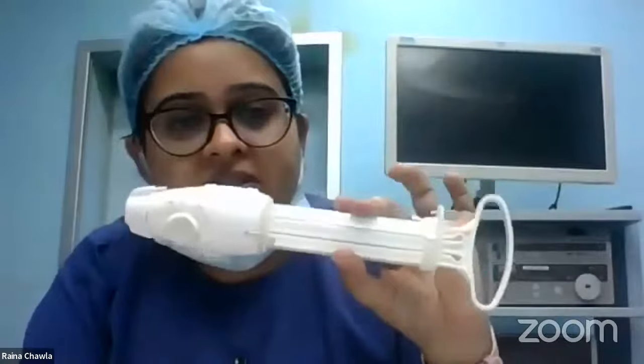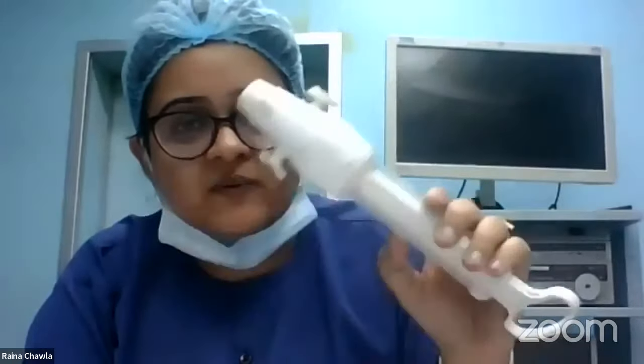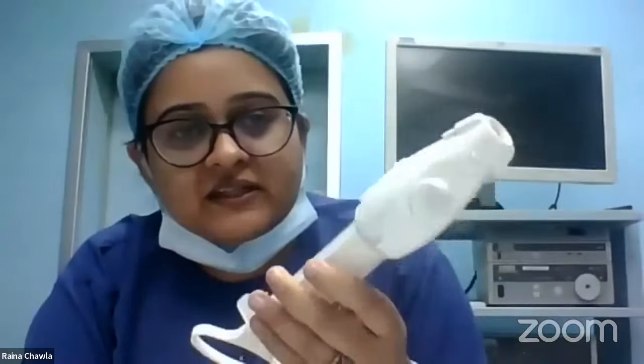You can also, instead of this, use the electrical suction apparatus, which is usually available in most modern OTs. But in a low resource setting, this is the instrument of choice. It doesn't require electricity. It is very easy to use. And by chance, if you've perforated the uterus, the negative suction will get closed off.